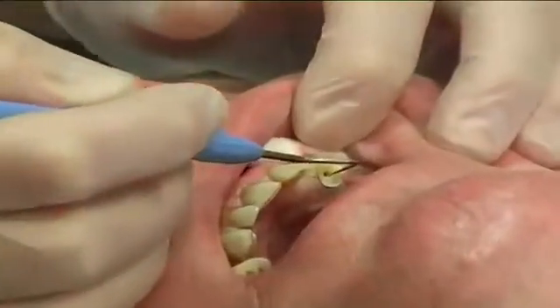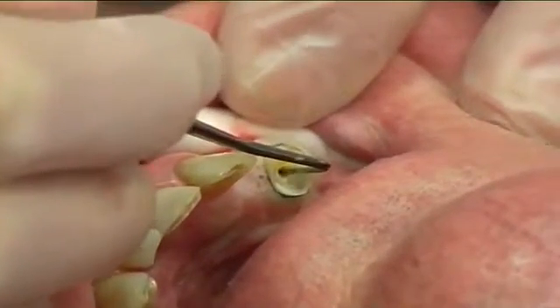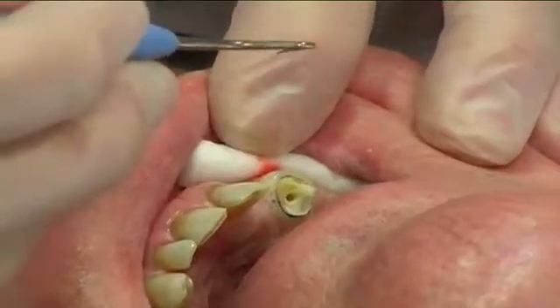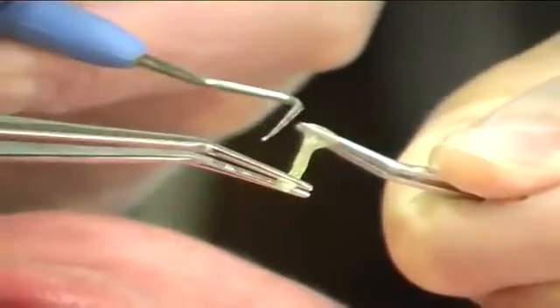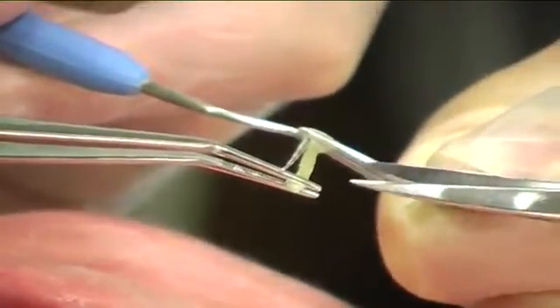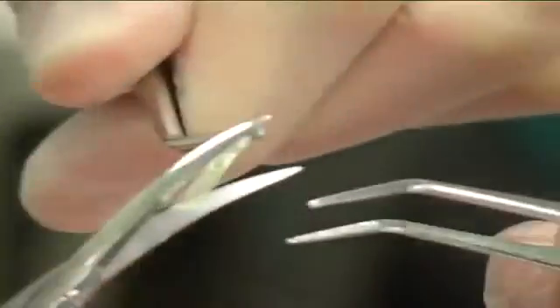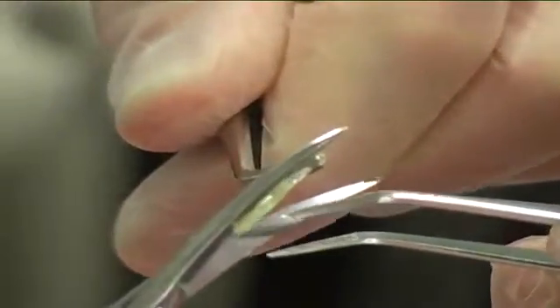The depth of the prepared canal was measured using a periodontal probe, and the height of the coronal structure needed was estimated. The post was cut to a suitable length with sharp scissors, and the end of the post was tapered with sharp scissors.